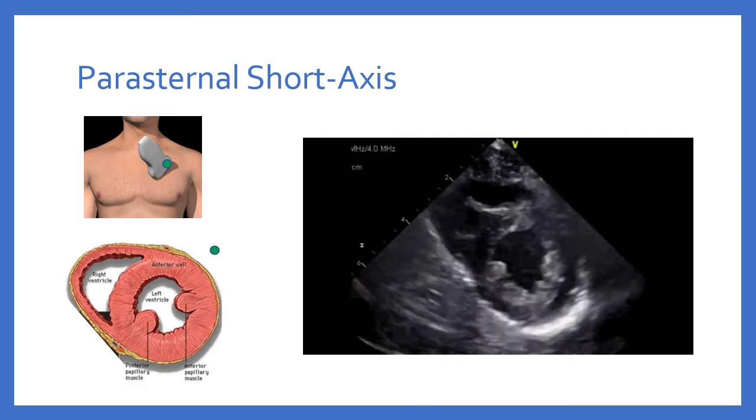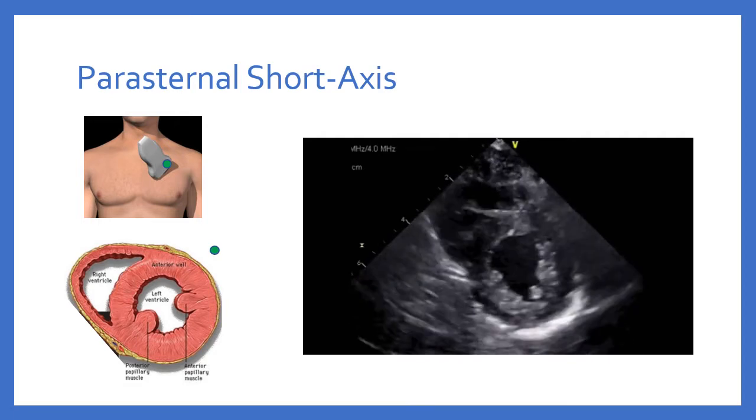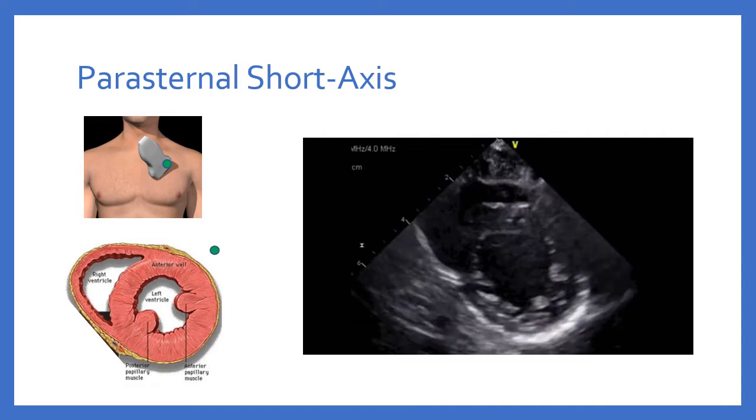From here, we can also get a good idea of whether or not we have a pericardial effusion, and so this image can be useful for many reasons.